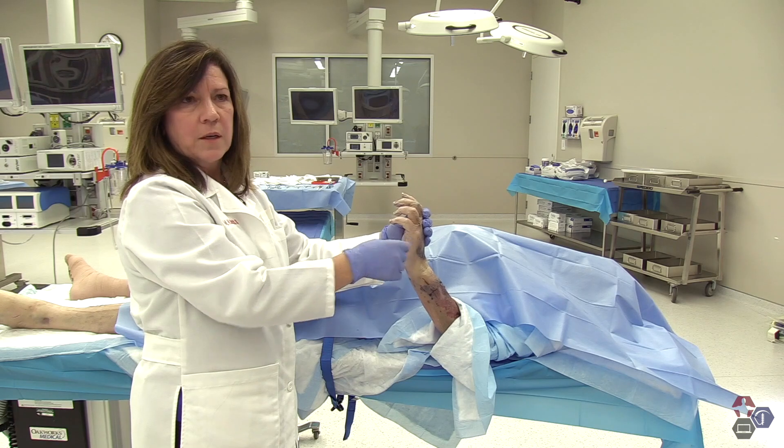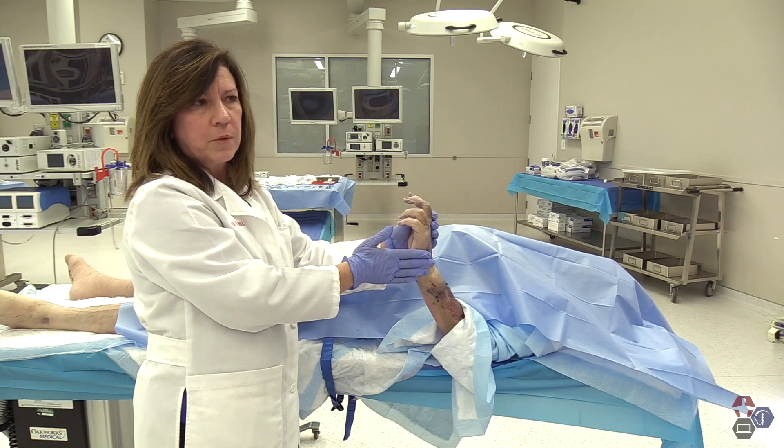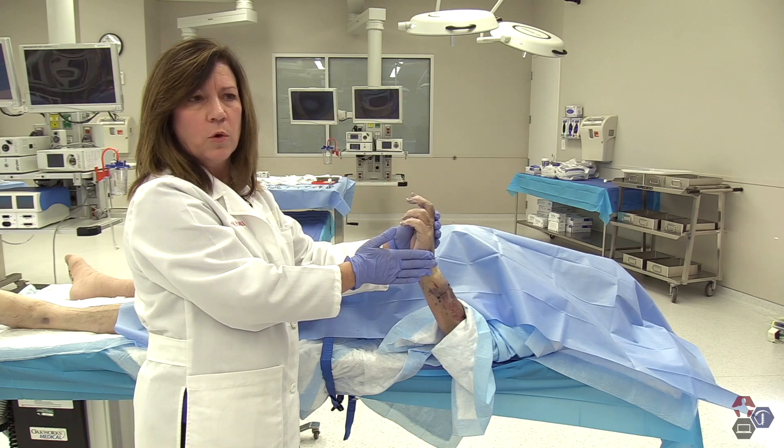Use two to three cc's and let them rub it a little bit until it sets up. The 2% plain lidocaine will help it set up quickly, and the half percent plain marcaine will help it last.